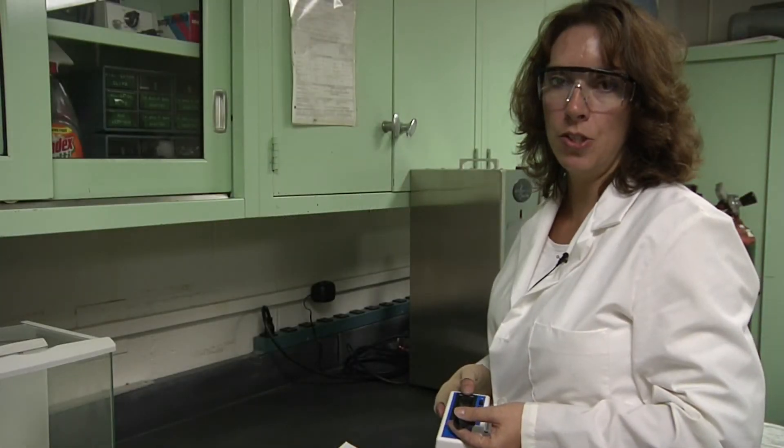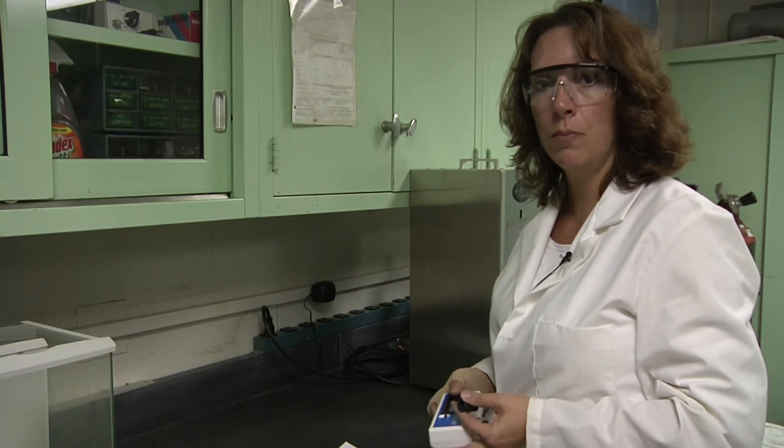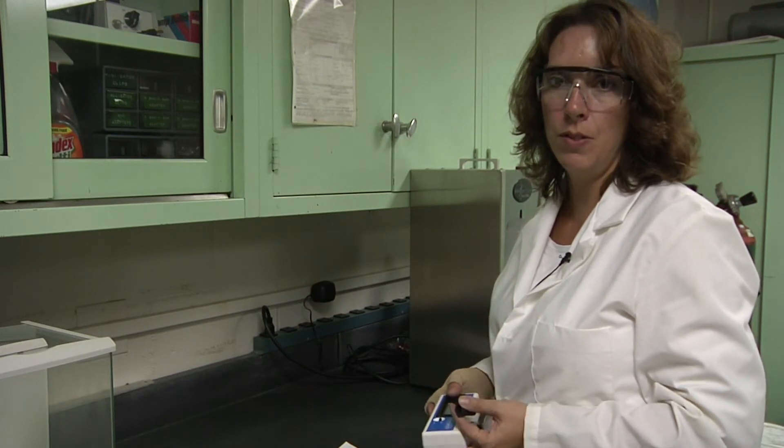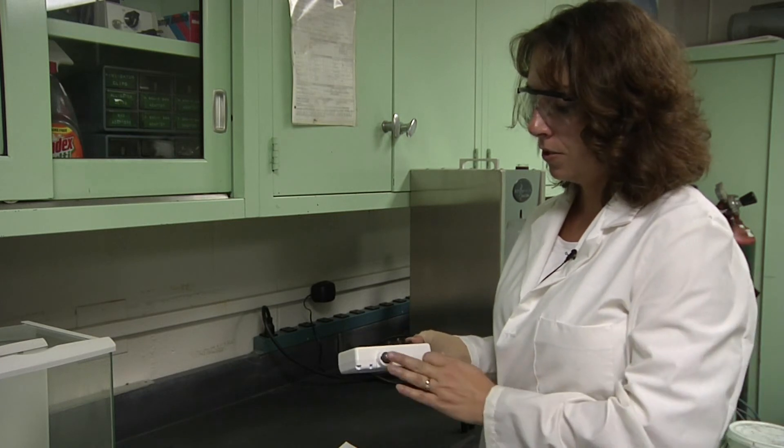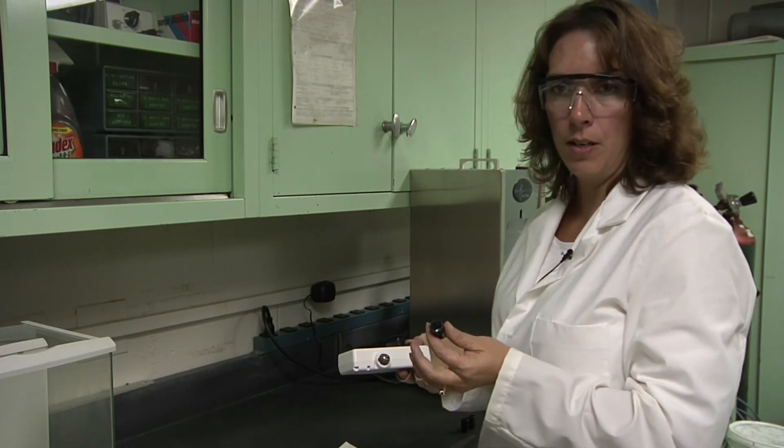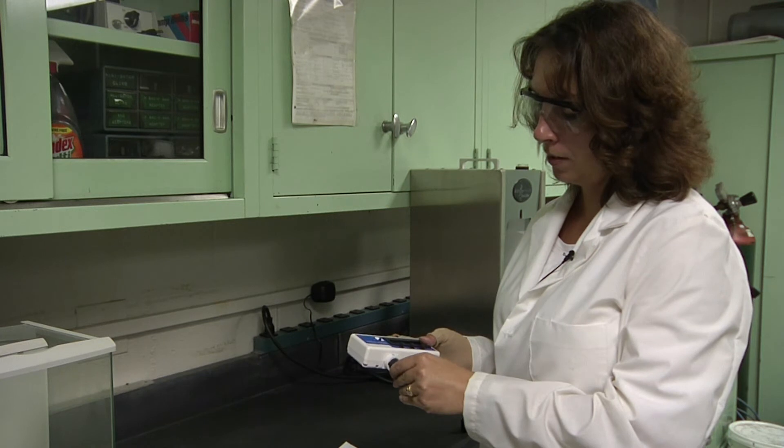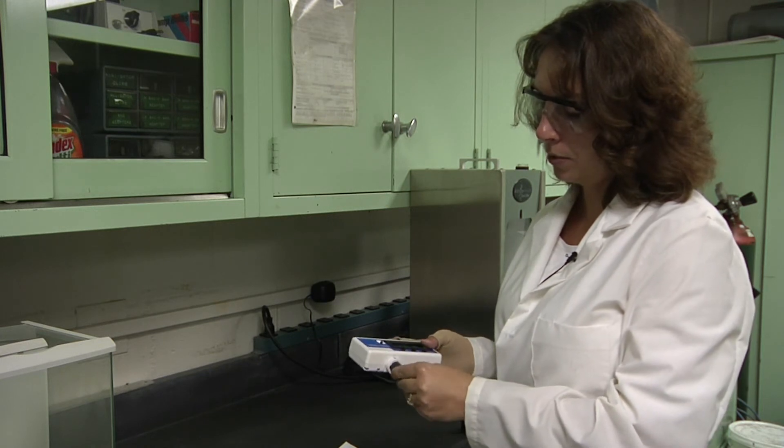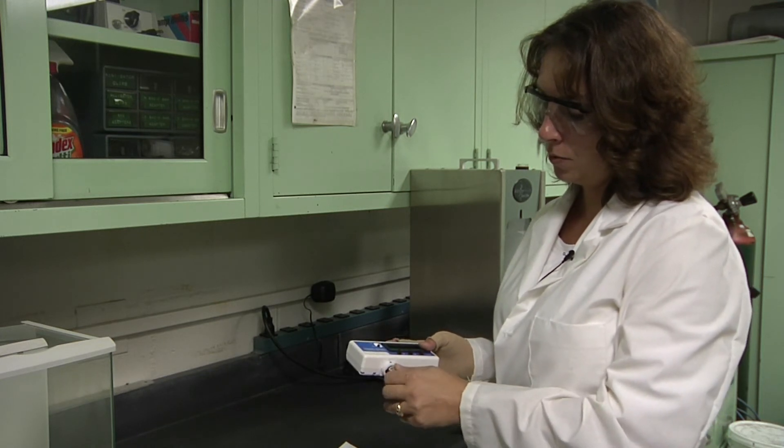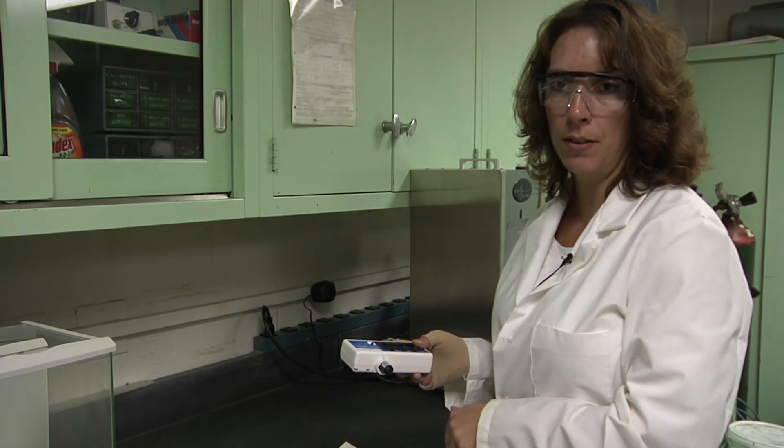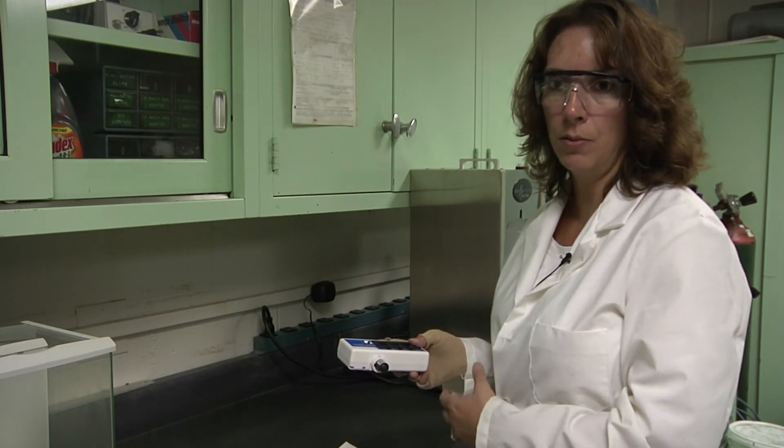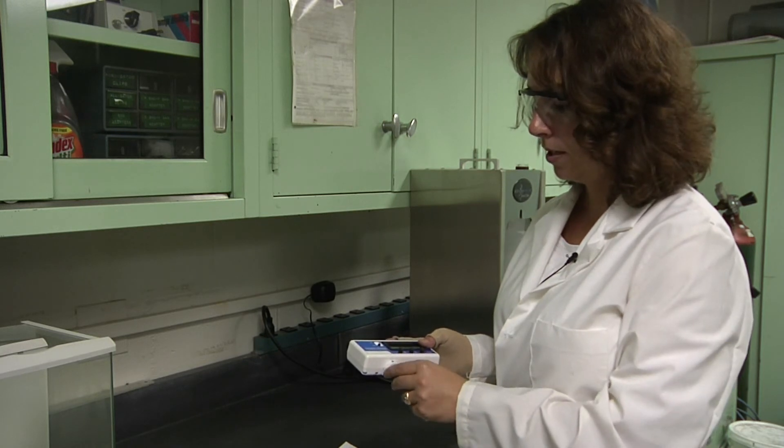There are some basic actions that you need to know to ensure proper usage and accuracy of your CDEM. One is to use the reflectance cup when traveling. Just simply put it on the probe, twist and lock into place to protect the probe when you are moving around either the mine or a building.